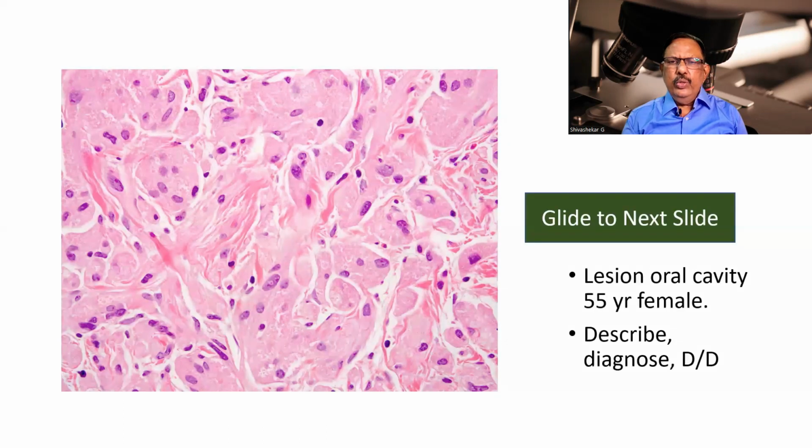We shall glide on to the next slide. The lesion in the oral cavity in a 55-year-old female. Describe, diagnose, and the differential diagnosis.